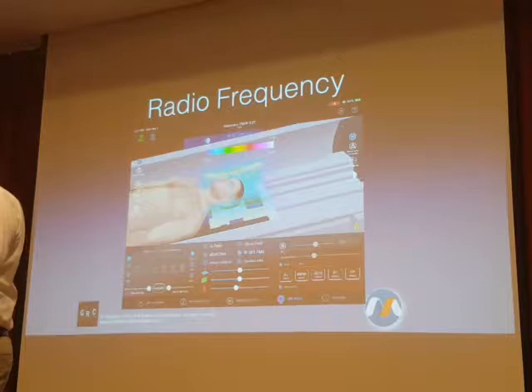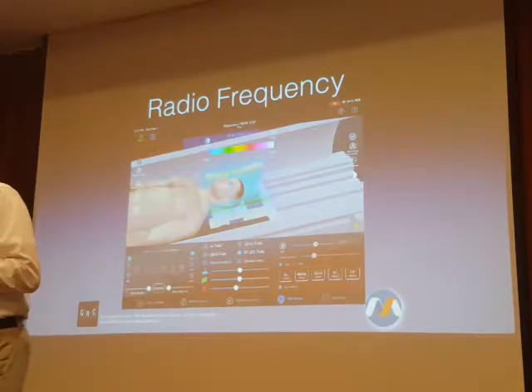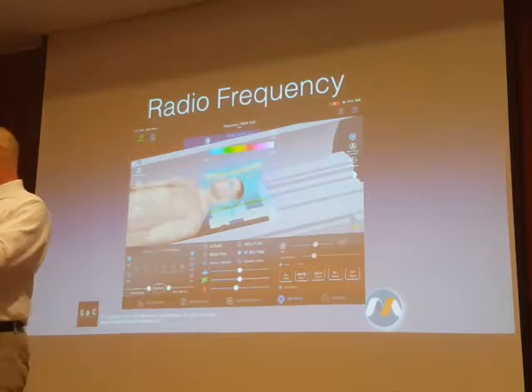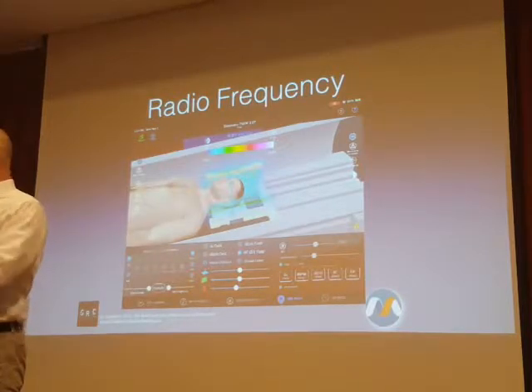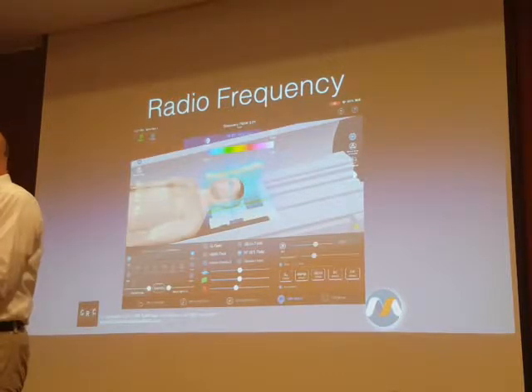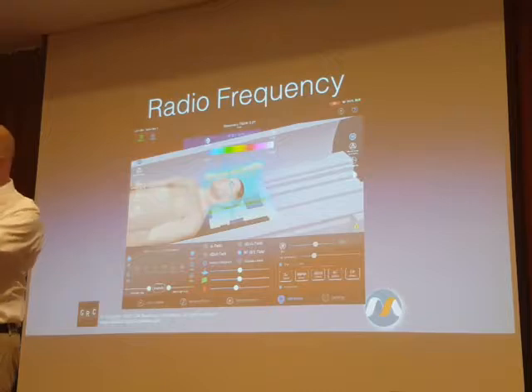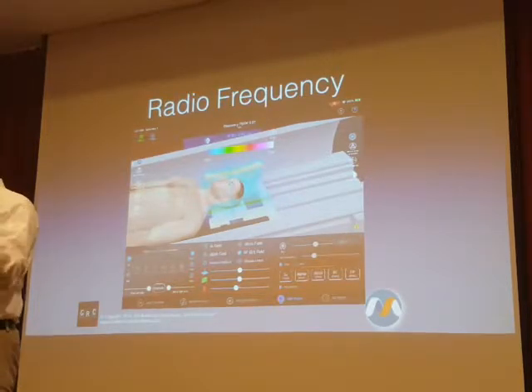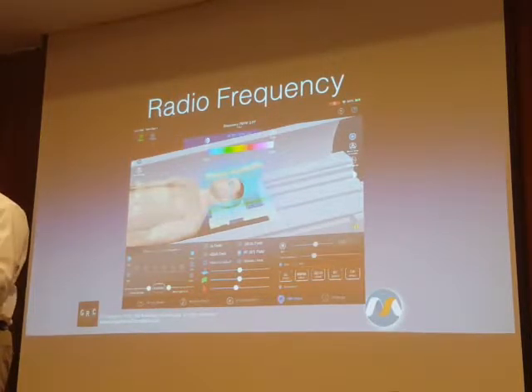If you no longer have those, or if they've fallen into disrepair, you can get replacement ones either from the manufacturer or from third-party vendors of pads. But in general, for every patient having a study using the body coil for transmit, which is the majority of our studies, if they're skinny like I am, and you feel confident that when you tell the patient, make sure you don't touch the sides, you observe the position they're in, you make sure that they're not touching, and that there's adequate clearance, for those patients, padding really may not be helpful.